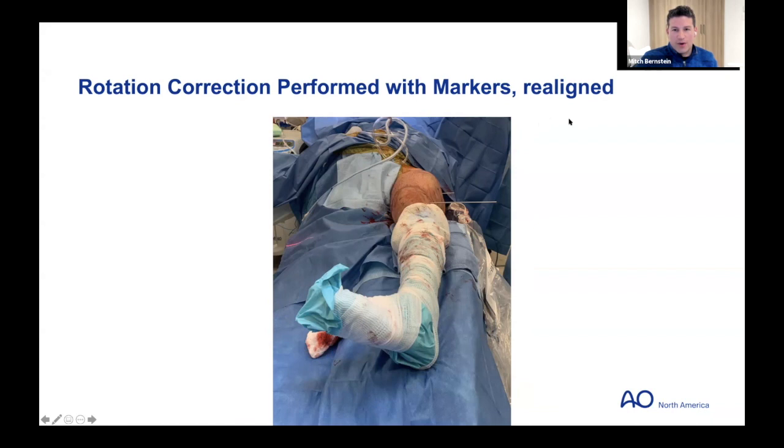What are your thoughts on that, Brad? Oh, I will try closed reduction for maybe 15 minutes. It's usually simple fractures where you get muscle trapped, and they're more difficult than the comminuted ones for overall alignment, and particularly rotation. But getting the coronal plane and sagittal plane, I feel like you can do that pretty repeatedly with percutaneous reduction aids.